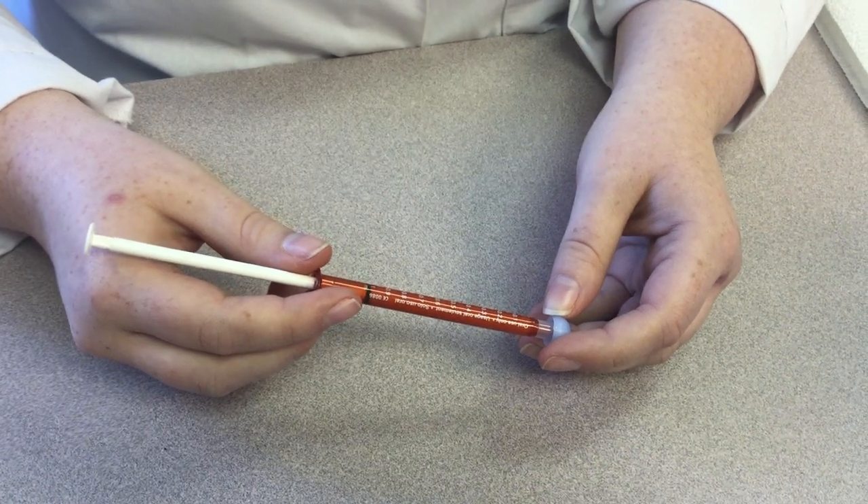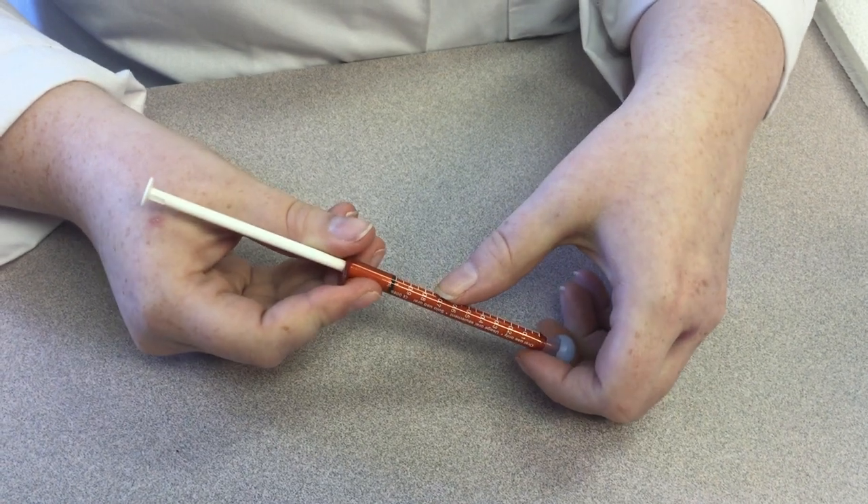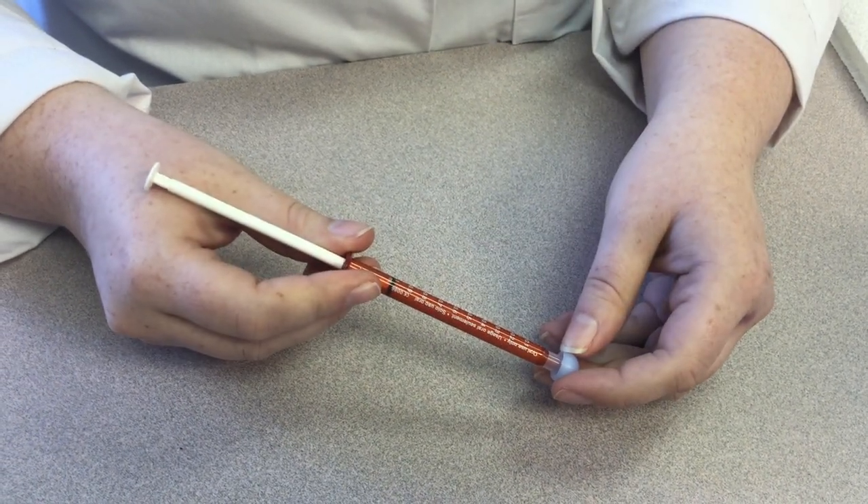In this video, we are going to show you how to dispense 0.25 mLs from a 1 mL syringe of cream for application.